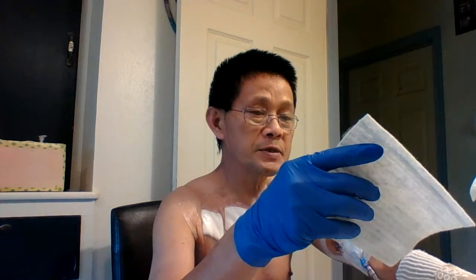And now everything is on the tabletop with the clean paper towel within reach, everything open, ready to use. Actually, the silver strip needs to be cut to the right length for the wound. This is the silver strip. It basically is silver that will absorb. Once you put it in, it will absorb any bacteria from the wound.